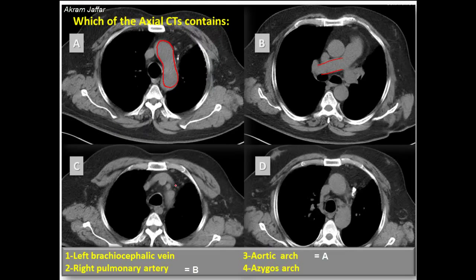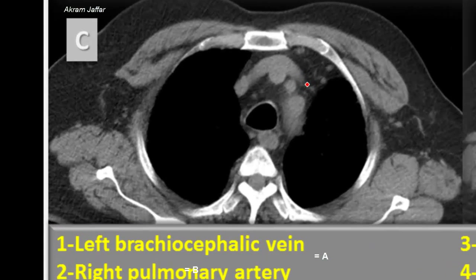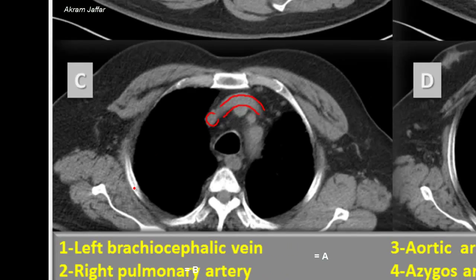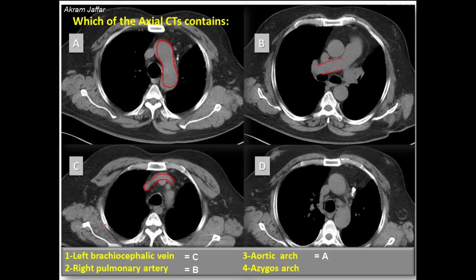In C, this is at a higher level than the previous two levels, and we can see here the three branches from the arch of the aorta, spiraling around the trachea. In front of these arteries are the veins, and so we have on the left side the left brachiocephalic vein. It crosses from left to right side across the midline to join the right brachiocephalic vein, and then they will form the superior vena cava. So the left brachiocephalic vein matches with C.